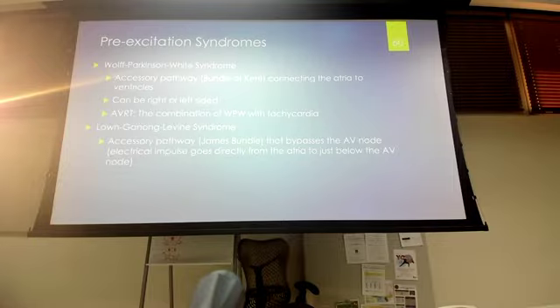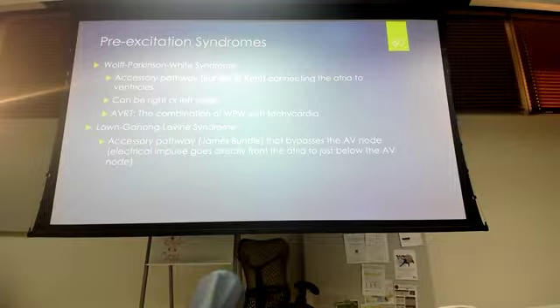If you recall, in our tachyarrhythmias we talked about this in association with something called AVRT. AVRT is tachycardic WPW. So people can have WPW and have a non-tachycardic rate. But if it's a tachycardic rate, we typically call it AVRT. So it's a form of SVT.